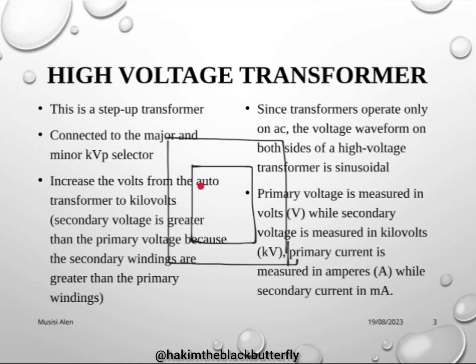And then we have the primary where we have these windings of wires, and this is the secondary and the primary.